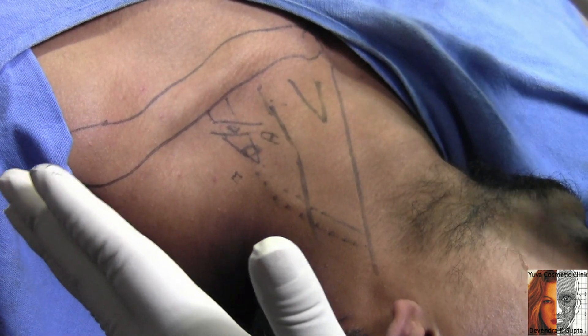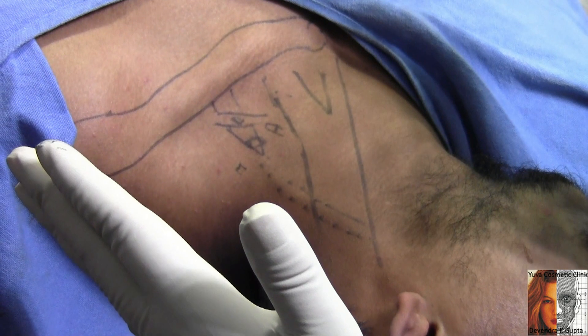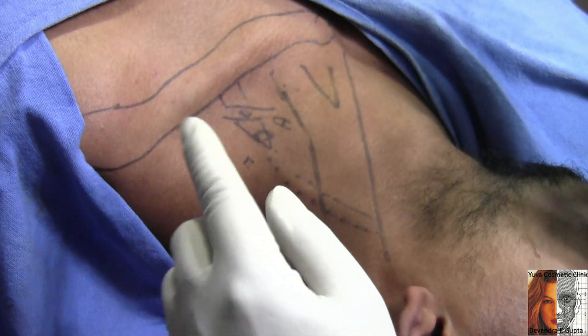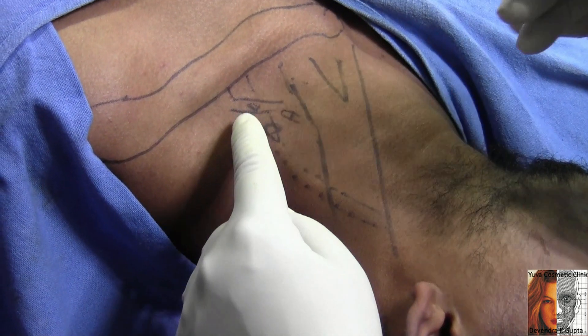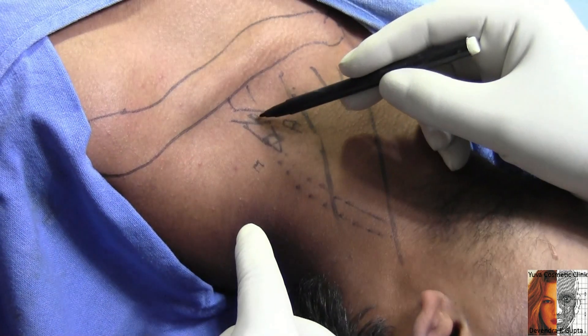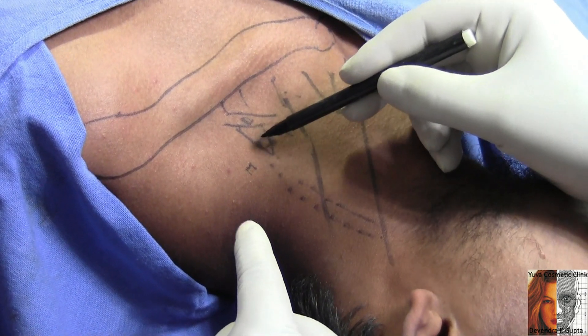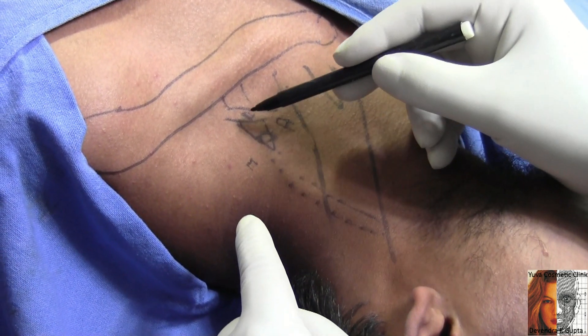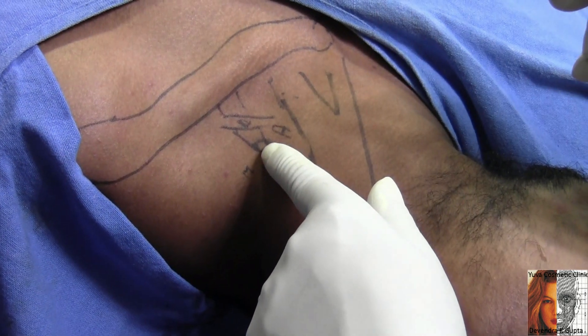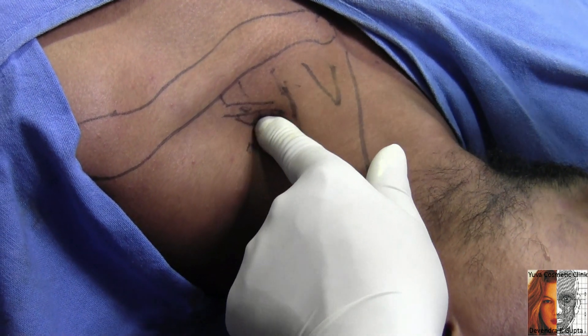This is my own technique — Devendra's technique for brachial plexus block. This is the supra-omohyoid interscalene triangle technique, meaning above the omohyoid but within the interscalene groove — the supra-omohyoid interscalene triangle technique for the brachial plexus.